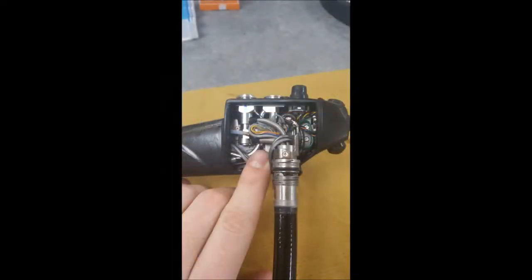Inside the side cover of the control body is all the wiring passing from the distal tip to the light guide connector. Note the complexity of the components and wiring in here. Poor handling and care of the endoscope can easily cause damage, which could lead to a major repair.